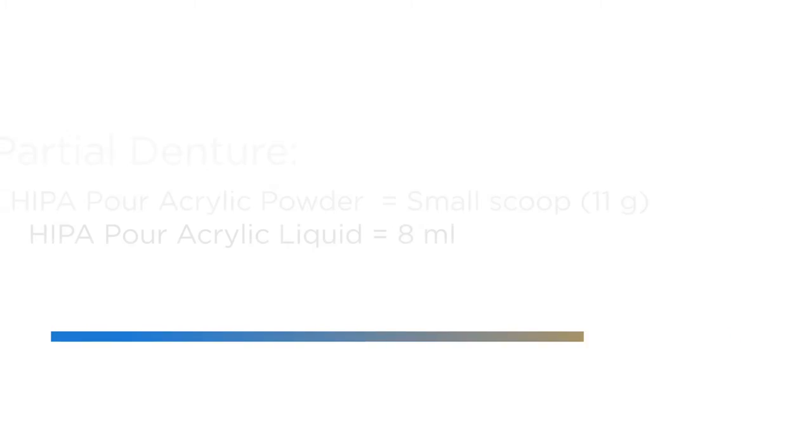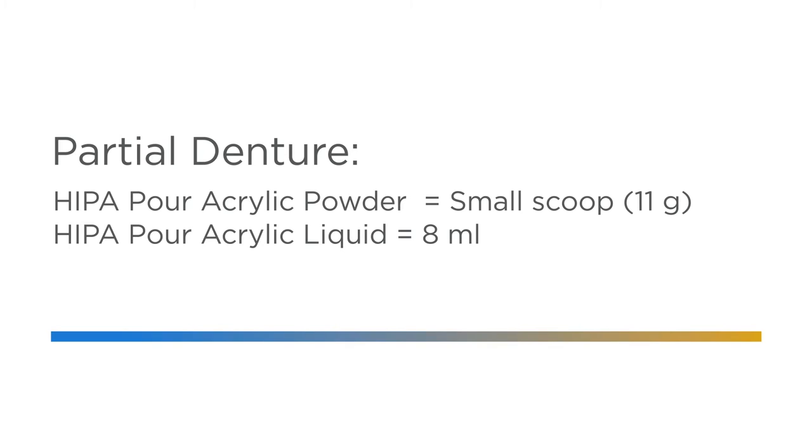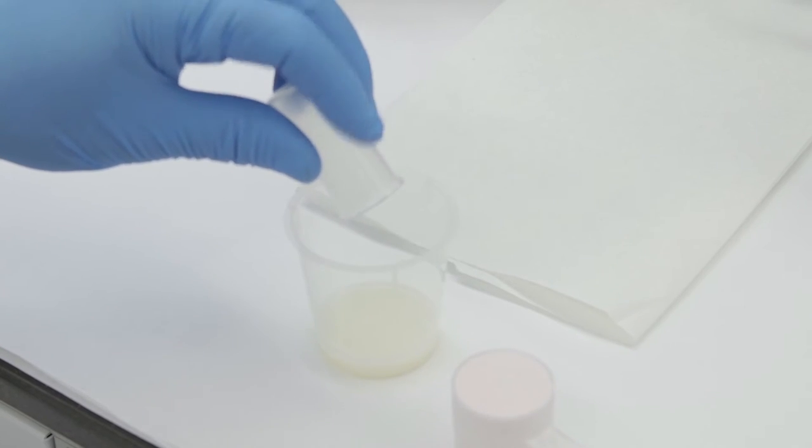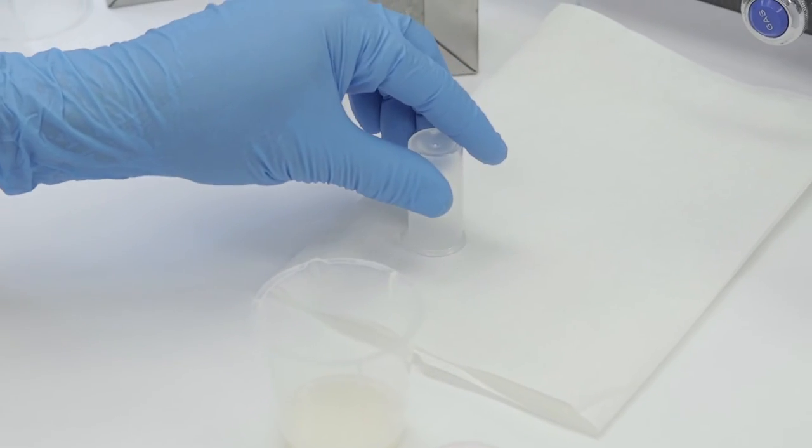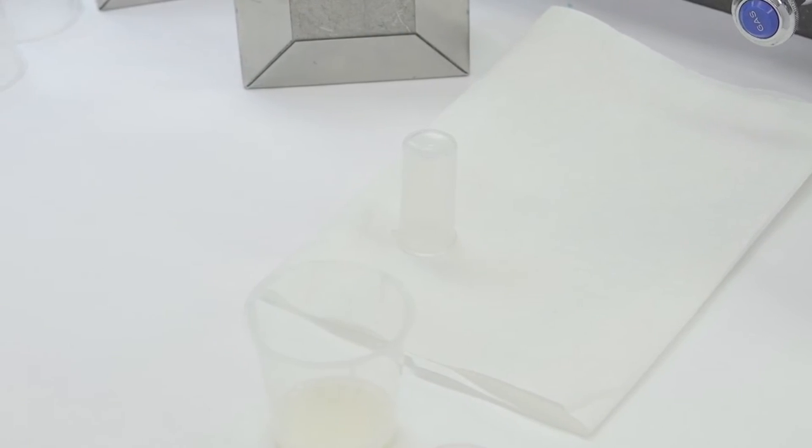For the fabrication of a partial denture, use one small scoop or 11 grams of HIPA Pour acrylic powder and 8 milliliters of HIPA Pour acrylic liquid measured with the HIPA liquid vial. After measuring the liquid, invert the vial on a paper towel to allow residual liquid to drain.